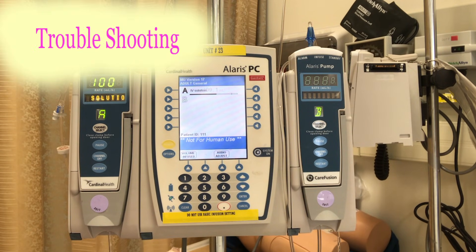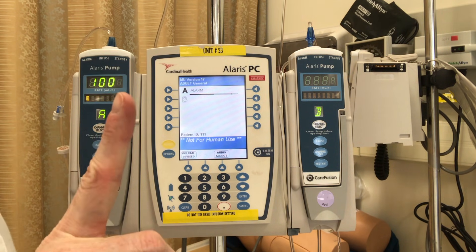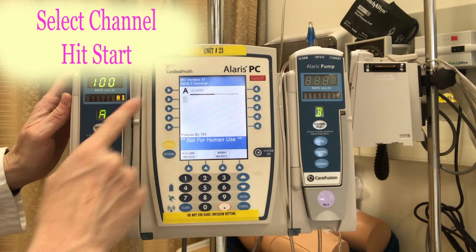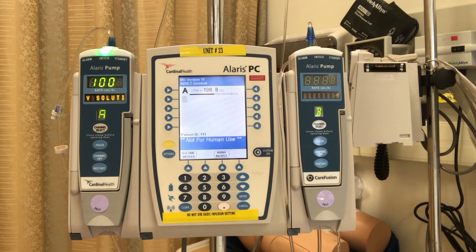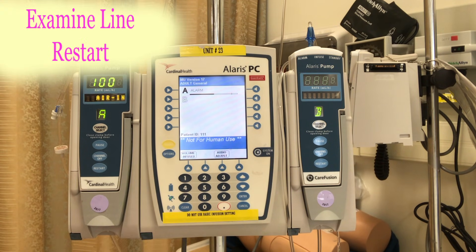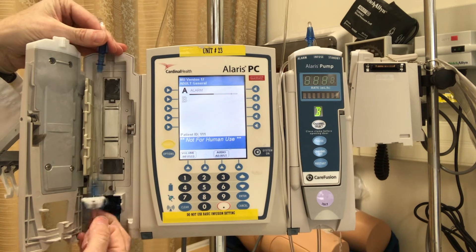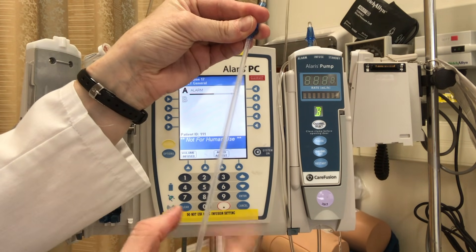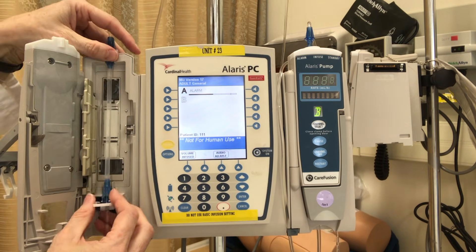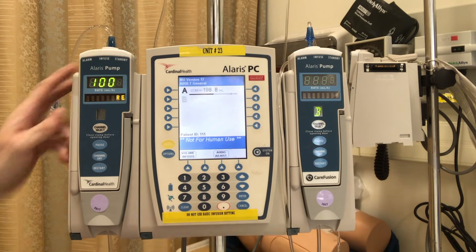Now let's look at some troubleshooting — what happens when that green light changes? For example, what if we get some air in the line? You'll notice the light has changed from green to red and it's flashing 'air in the line.' That means the tubing within the chamber is problematic. The first troubleshooting step is to select the channel and hit start. If that doesn't resolve it, you'll get another air-in-the-line alarm. Step two is to take the safety clamp off and examine the line inside the chamber. I can see a few air bubbles, so I'm going to gently stretch the line and flick those air bubbles upward to get rid of them, then seat it back in the pump. Wait a few seconds to make sure the pump is working properly.